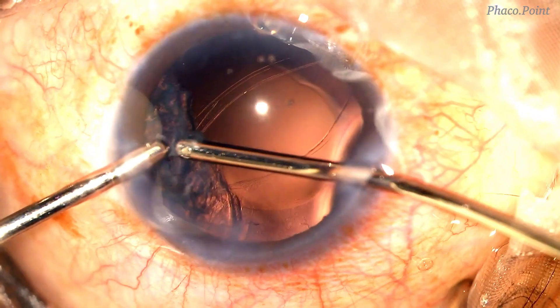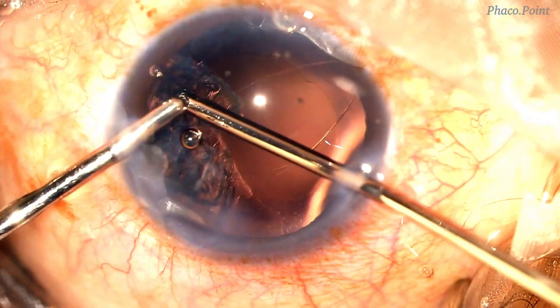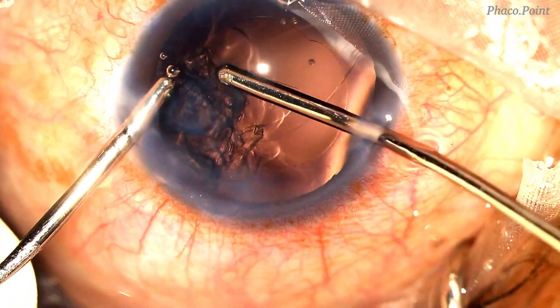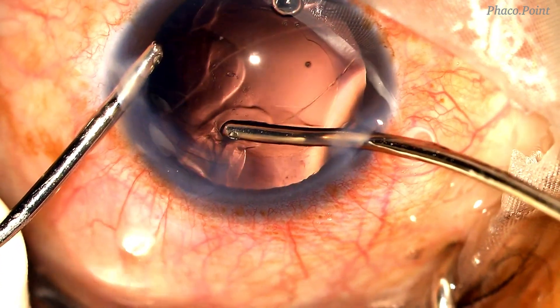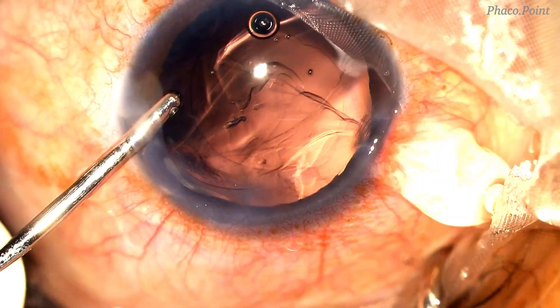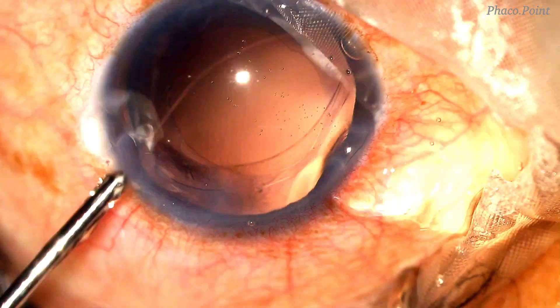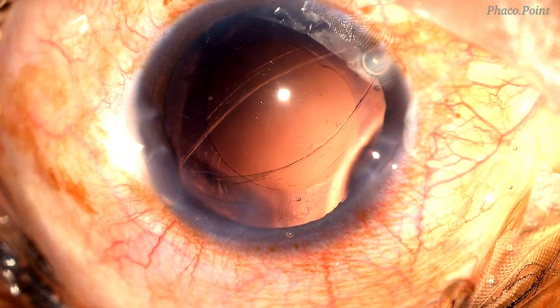Let's watch the last part of the cortex removal. Note how with care and caution the cortex is drawn out into the centre and quickly aspirated. This completes the cortical wash. We once more perform a visco-fluid exchange prior to bringing the irrigation out of the eye. Visco-fluid exchange maintains anterior chamber depth and prevents vitreous herniation.